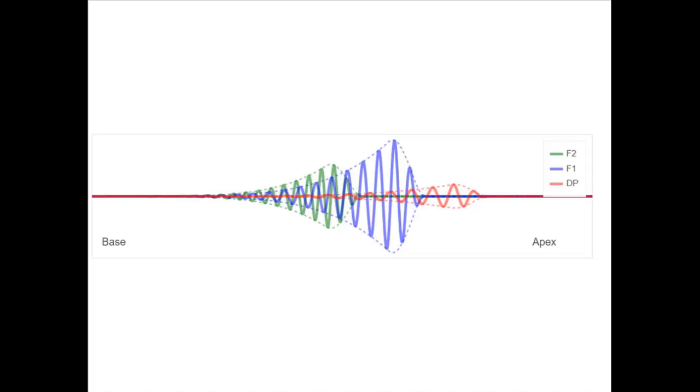And so now we have a situation where the site of primary generation is sending energy back, and the characteristic place of the DP frequency is sending energy back. That travels back to the middle ear and mixes with the first component, and that can either add to or subtract from it, depending upon the phase, and contributes to what we call the fine structure of DPs. The other webinar earlier discusses that in more detail.